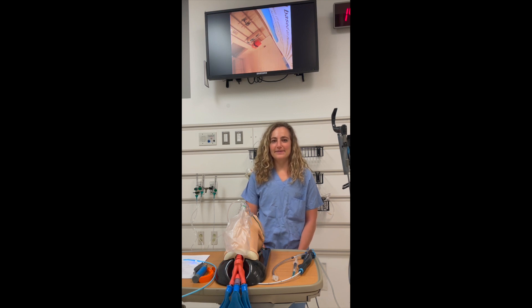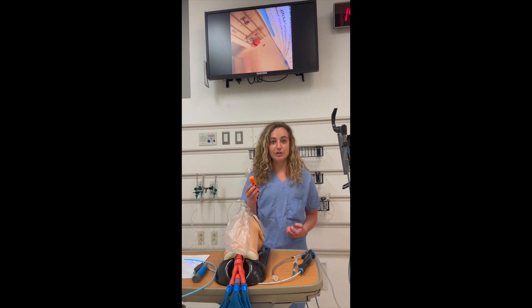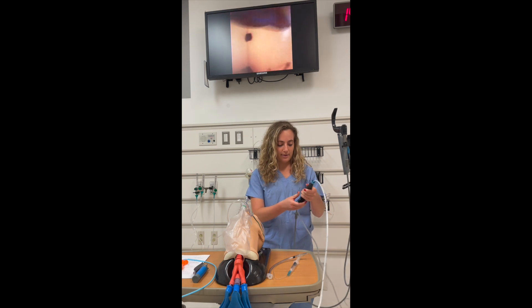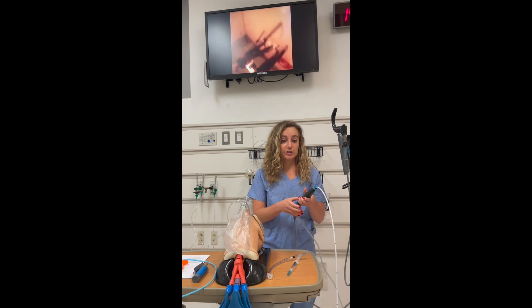Let's talk about the setup for fiber optic intubation and all of the materials you'll need to have ready before you start. We're going to assume you have some experience with intubating. You want to have suction ready, pre-oxygenation ready — this mannequin has a nasal cannula and a non-rebreather. You also want to have your airway adjuncts ready; sometimes you can use an oropharyngeal airway to aid you. And you want to have your actual fiber optic — for this video we're using the Glidescope B Flex, which connects straight to suction, which can be helpful during the procedure.